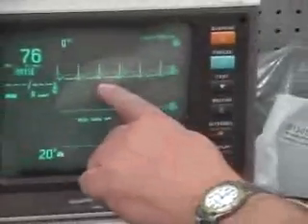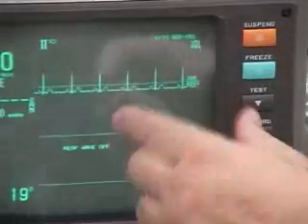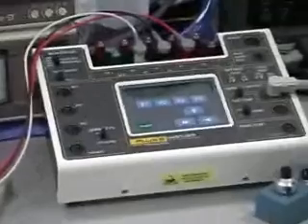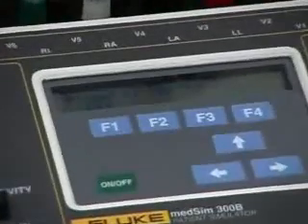So as you can see here, we are bringing it tighter, with a shorter interval and a narrower R wave. Definitely if you have any of the neonatal monitors, that does work out quite well. That also lowers the blood pressure by 25%, so the pressure is more comparable to what you'd be looking at for the babies.